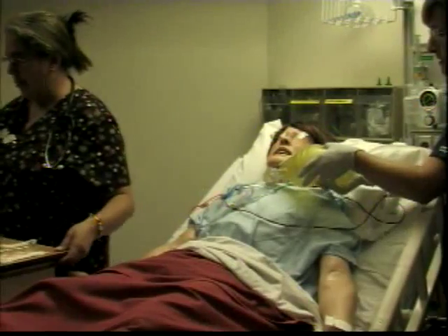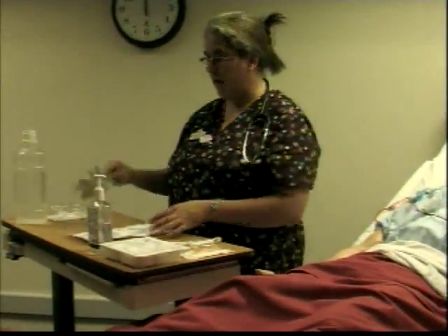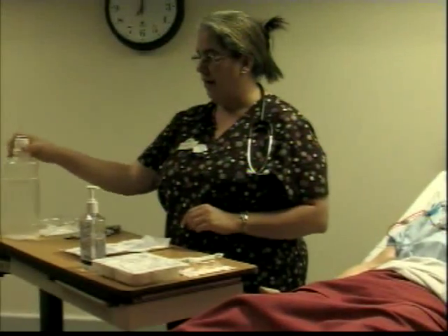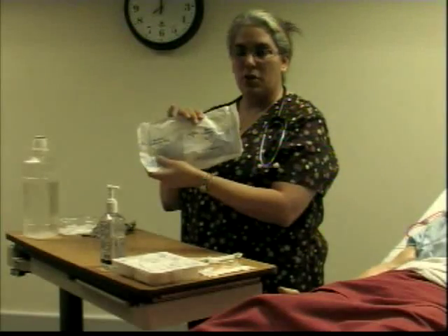While she does that, I am going to go ahead and get my equipment ready. I have my clean gloves, because I'm going to be removing the split gauze, and I'm going to show you that in a minute. I have my saline that I'm going to need. I have my suction kit.